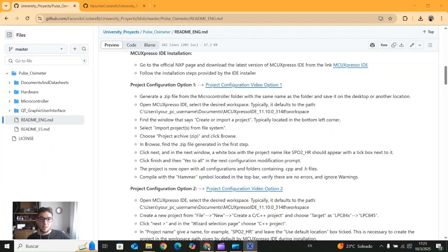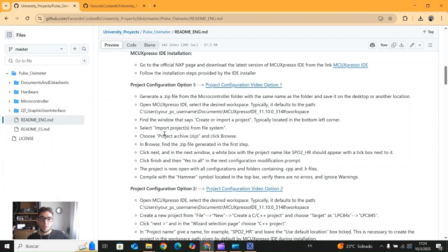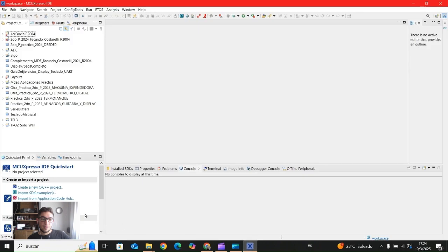Now we need to do the next step, which is to find the window that says create or import the project, typically located in the bottom left corner. So we go to the bottom left corner, which is here, and then create or import the project. So we are going to import project from file system. Then we are going to choose a project which needs to be in zip format, and well, just import that project. So we click on import projects from file system.